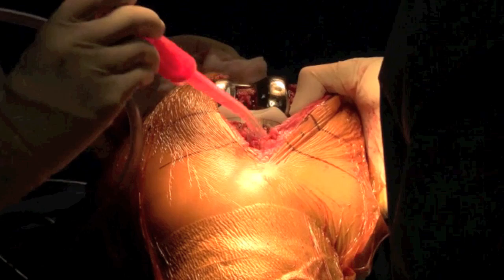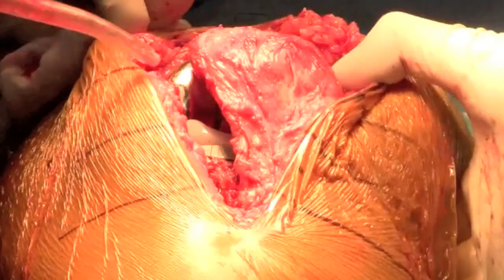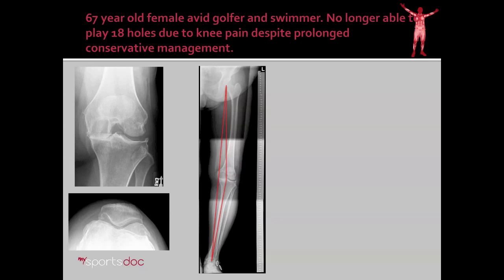Here you see another patient's knee. I wanted to show the components — I'm pointing out the PCL there and showing how the PCL keeps the knee from sliding backward. And there you can see the knee going through a range of motion, so you get somewhat of an idea of how the knee is going to work. Then when I put the kneecap back in place, you can see how the kneecap is going to run in that groove as well once the arthrotomy is closed.